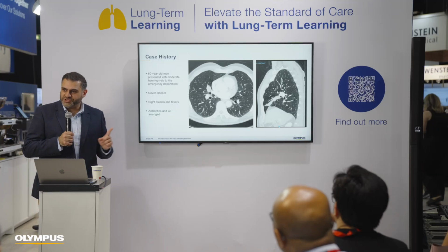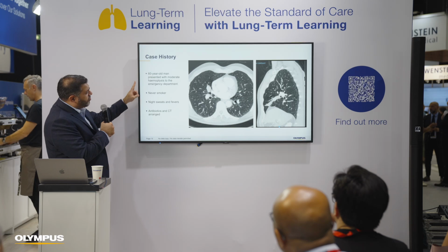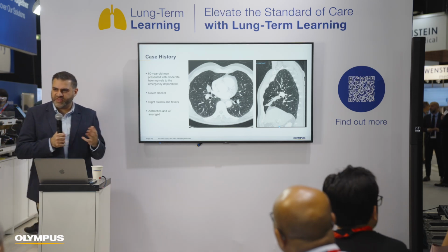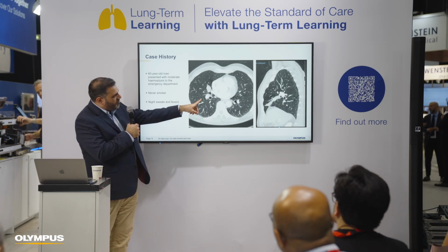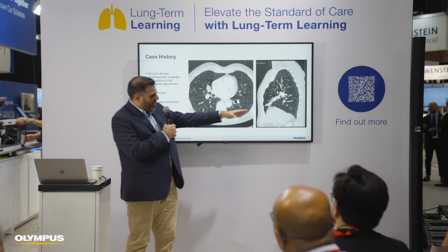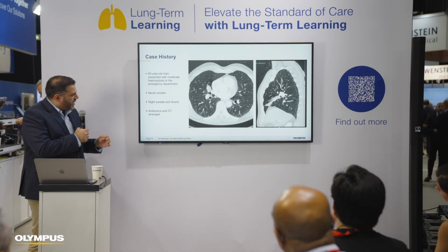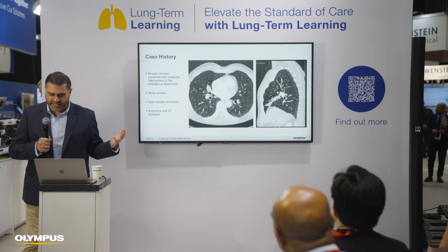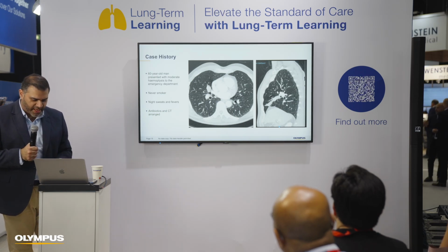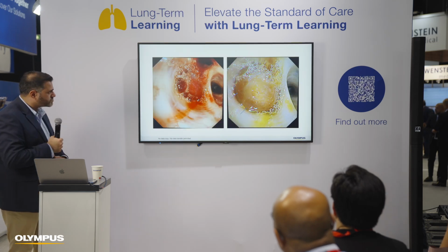Okay, so we're into postgraduate bronchoscopy now. So this is a 60-year-old man who came in with fevers and night sweats. He had on his CT a blocked right main bronchus, and then this sort of band of atelectasis that comes all the way down. And he was a never smoker. He'd had some antibiotics. The ED had done a CT scan, which you can see there. And then we'd arranged for him to have a bronchoscopy.